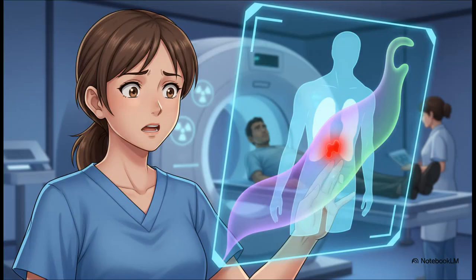And look, this isn't just some academic curiosity. These phantoms are a big deal. They can completely obscure critical anatomy, or they can masquerade as a disease, leading to a misdiagnosis. This often means we have to do the scan all over again, which, as you know, means more radiation for the patient. So it's time to meet the culprits.